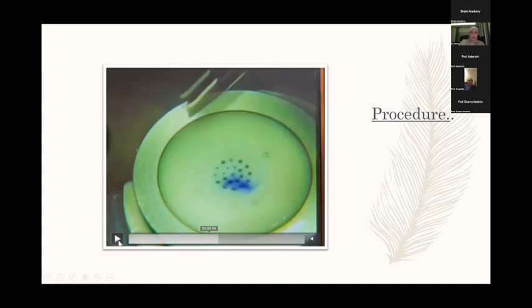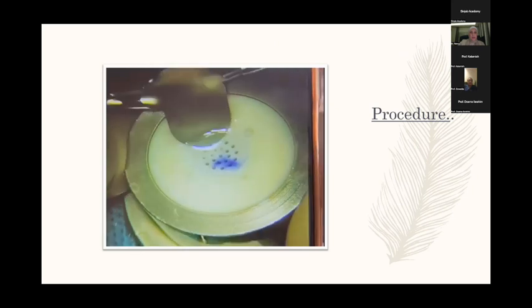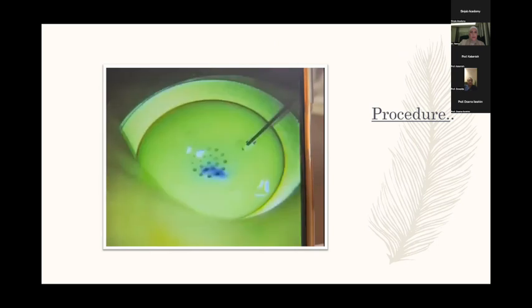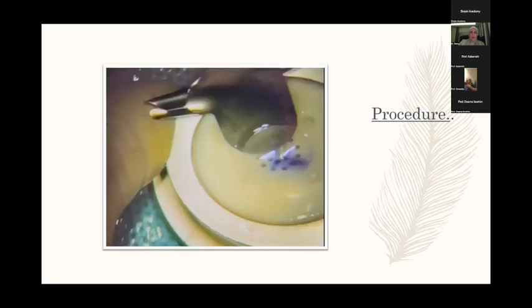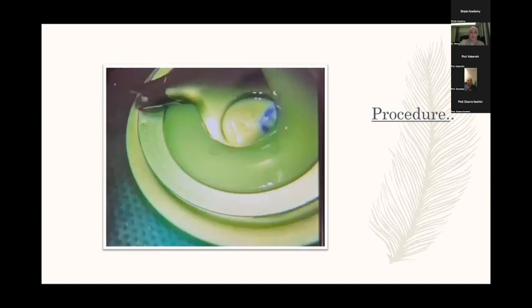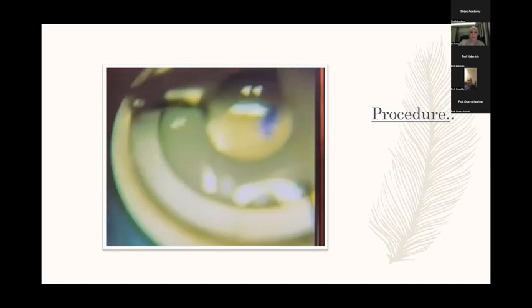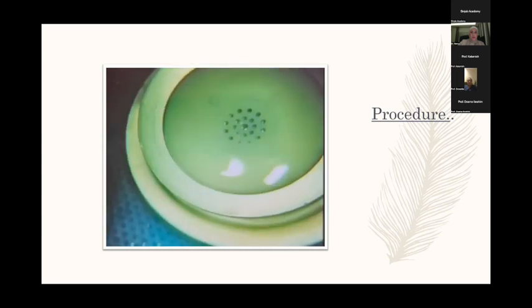Okay, so after cutting, it's so ultra thin that it floats. It's a no-touch technique. It floats over the BSS. So I just load it with fluid, and it floats, and I scoop it using the Busin spatula without touching it. I just use fluid to make it float, and then I scoop it over the spatula. And sometimes I use a second instrument like a Sinjab hook or a very fine instrument, and I go from the stroma side to just tuck it onto the spatula.